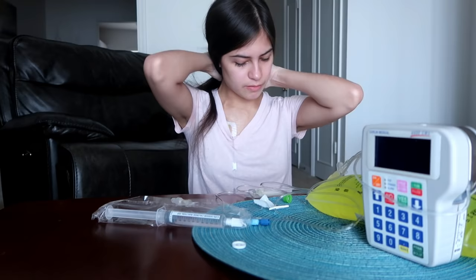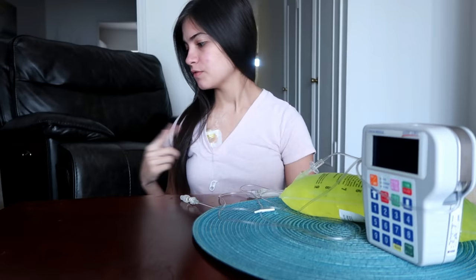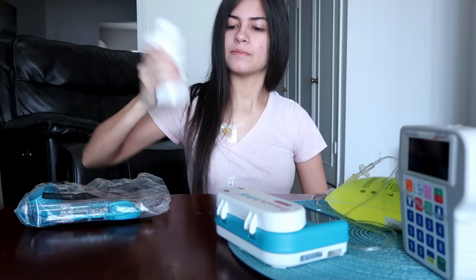Ta-da! I am all ready to hook up to my banana bag today. So much trash. Now I need to make my new feed bag. And in honor of Feeding Tube Awareness Week, I will show y'all how I prepare a feed. First, I shake up the formula. Get the feed bag out.